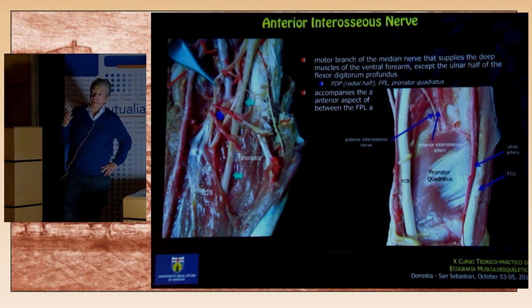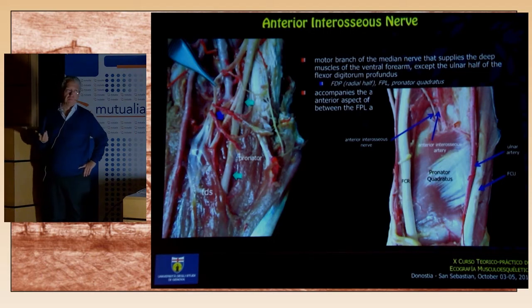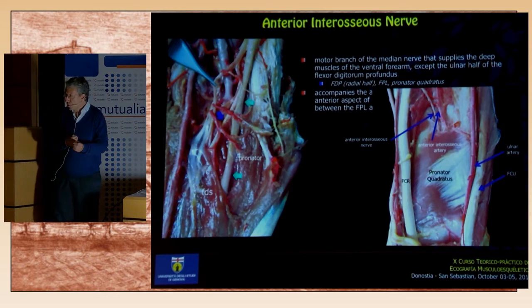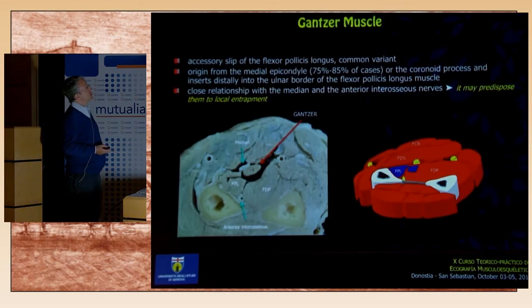Then remember that, as Jordi said at some congresses, I don't know, in Barcelona, in one of the congresses, this is absolutely true: this nerve is often involved by Parsonage-Turner syndrome. So there are some conditions in which the nerve is involved, not just as a result of compression. So it's really difficult. So you have to refer to muscles.